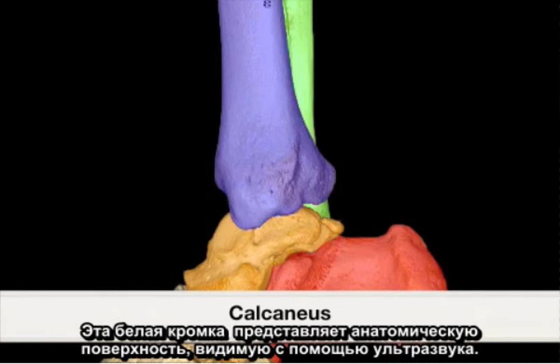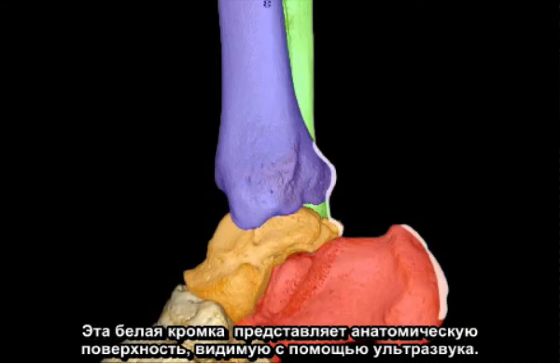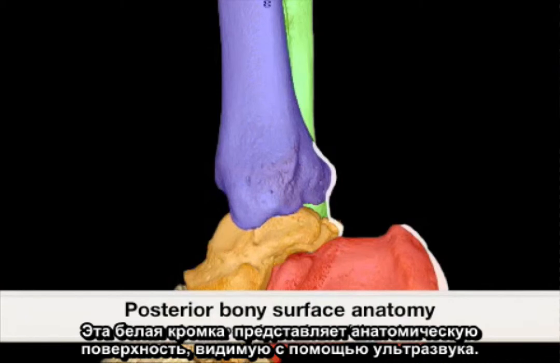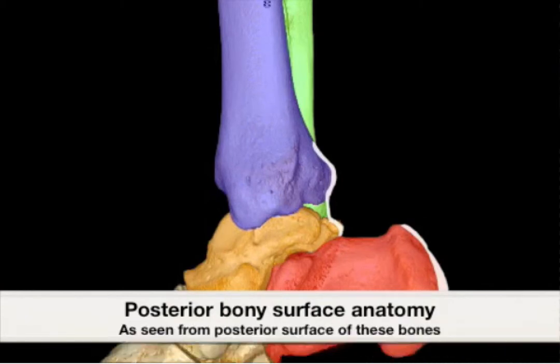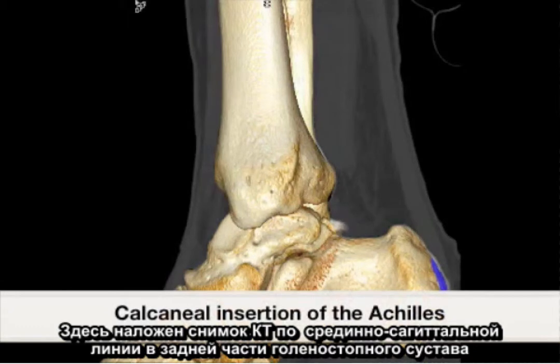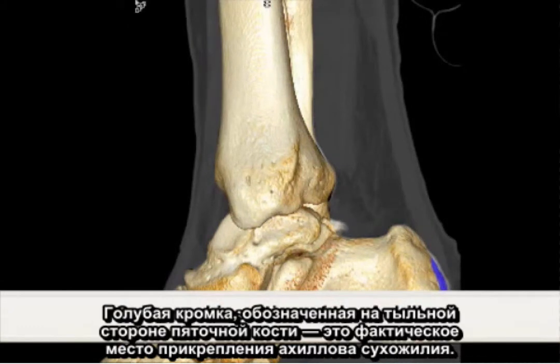This white rim represents the viewable surface anatomy by ultrasound. Here is a superimposed CT scan at the mid-sagittal line of the posterior ankle to put into perspective our general field of view.